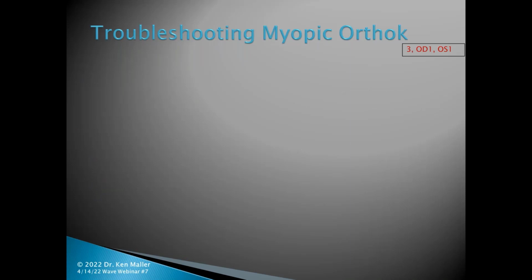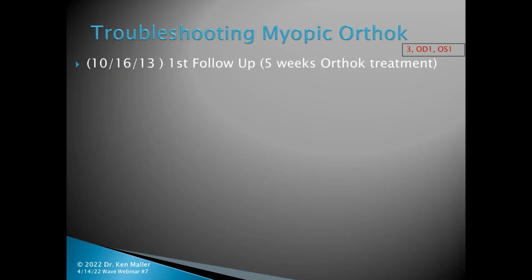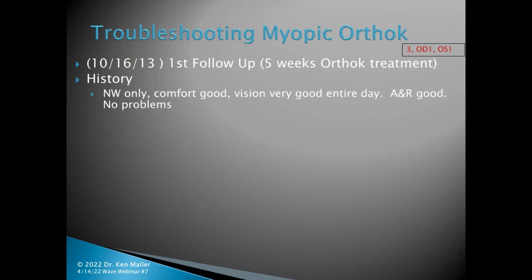So at his third visit, he's on right lens number 1 and left lens number 1. He's 5 weeks out. He didn't quite come back in the 2 weeks. I'm not really sure what happened there, but he came back about 4 weeks later. Nightwear only, comfort's good, vision's very good the entire day. He's doing great getting the lenses on and off. He had reported no problems whatsoever.